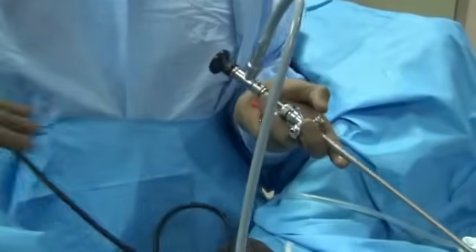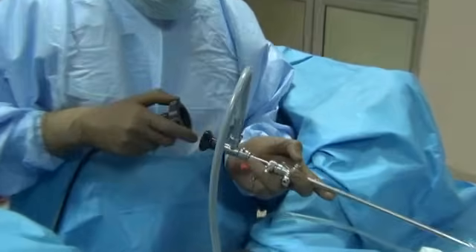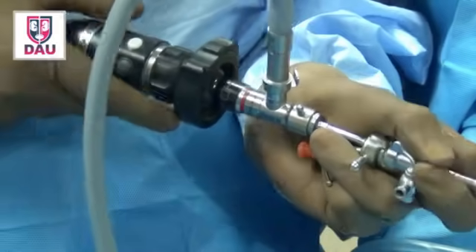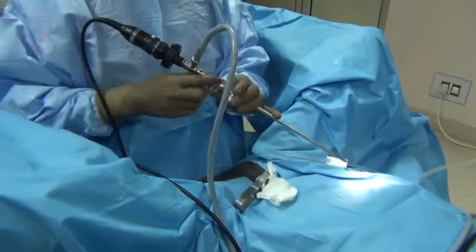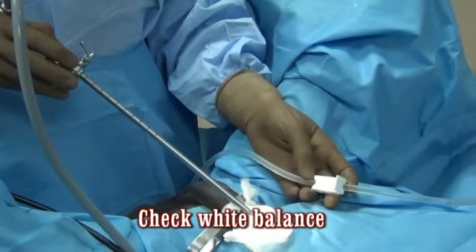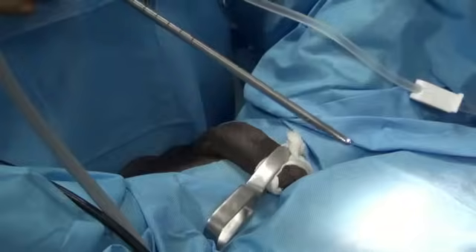Then connect the camera. Before coupling the camera with the scope, make sure there is no water on either surface — if there is water, clean it, because a water film in between will blur your image. Rotate and couple it securely, and ensure they are nicely fitted. Once the lens, light source, and camera are assembled, perform white balancing. For white balancing, use a flat white surface — such as a gauze piece or something even more flat, clean, and white — place the lens over it and press the white balance button.